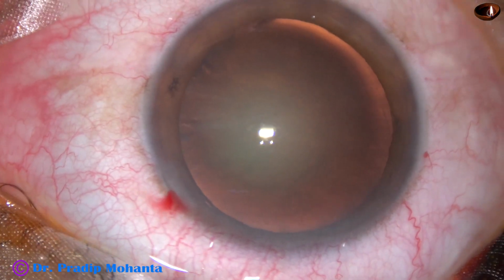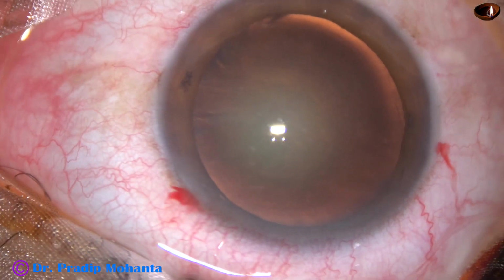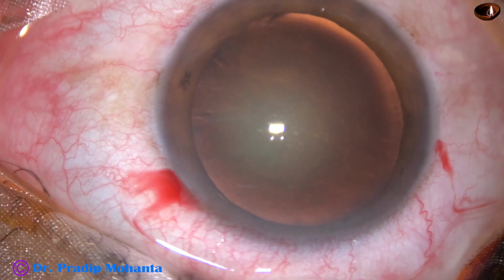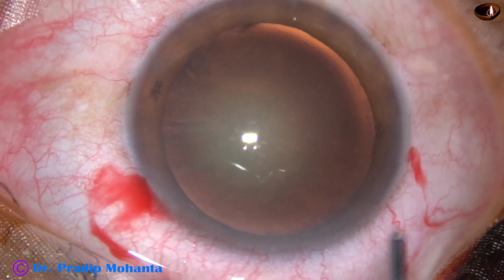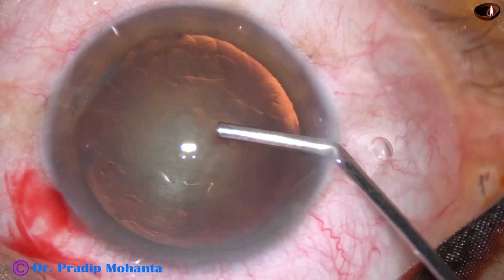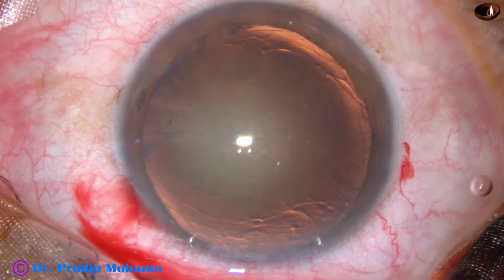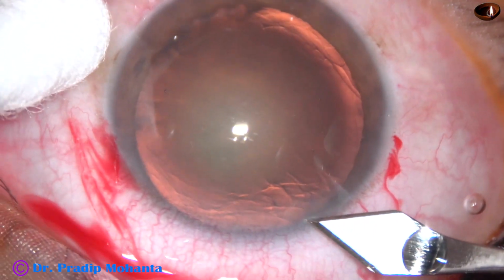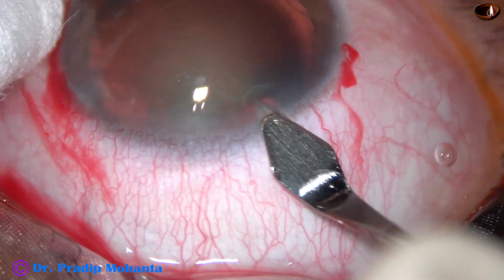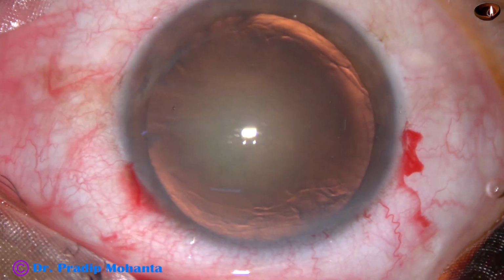And now, 2% hydroxypropyl methyl cellulose is injected into the anterior chamber. The antechamber is filled up with 2% HPMC. And now, a 2.8 mm main incision is made at 11:30 o'clock.